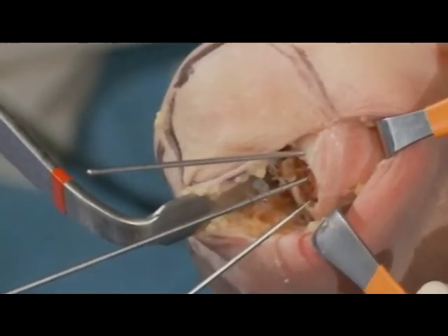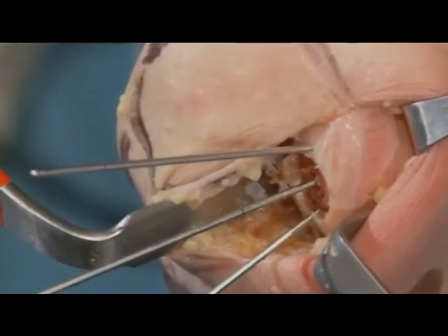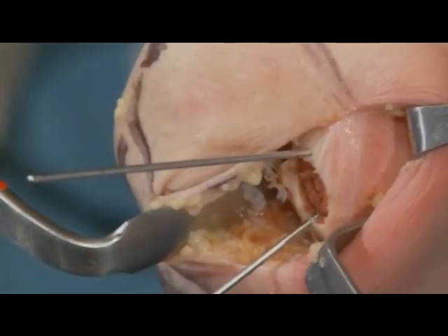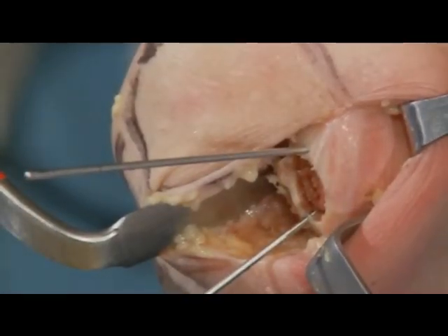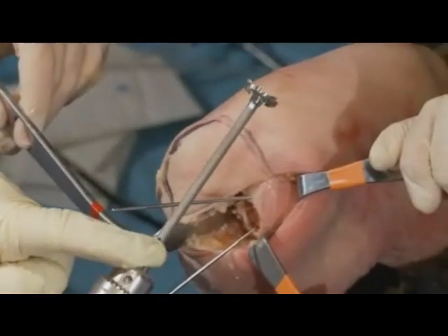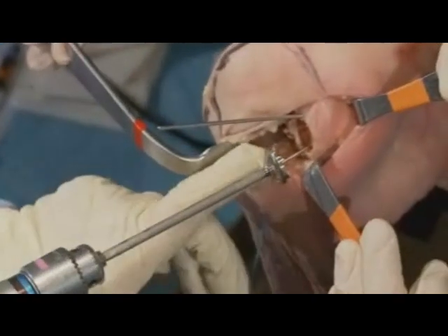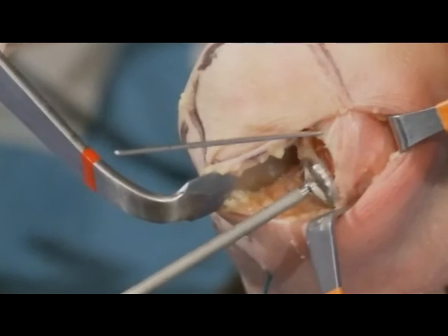So what we're going to do is take out our central pin now. And so now we're going to ream for our bottom and our top portions of the implant. So this is a 3 implant. What I want to show you, this device has a hole in it right here, and it gives you a strobe effect with the pin as it comes up, and it'll stop the reamer from going any further down. So I might just pull that down. So we just start that off the bone, and we come down again.